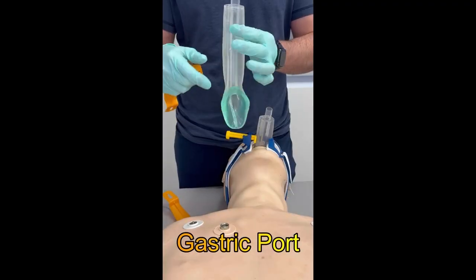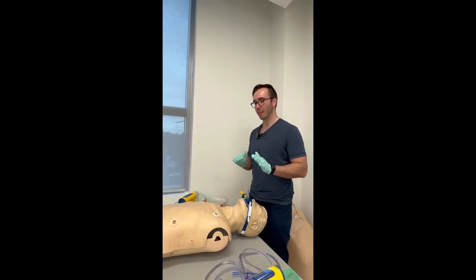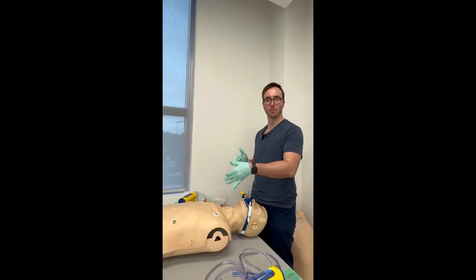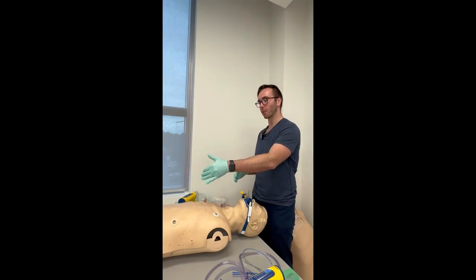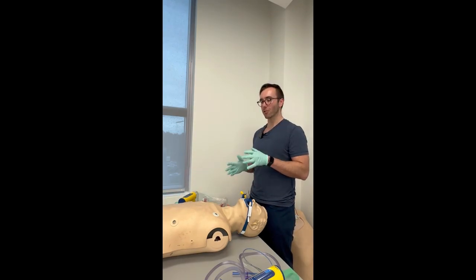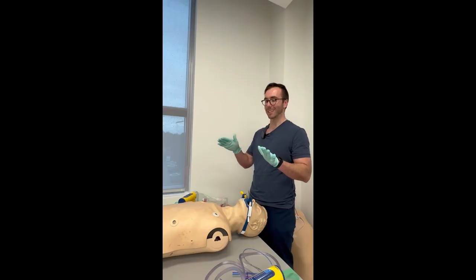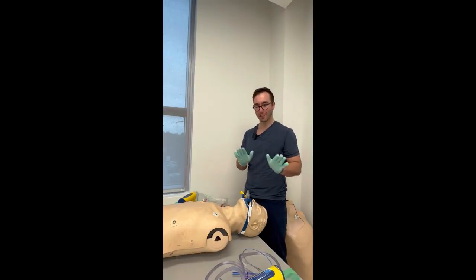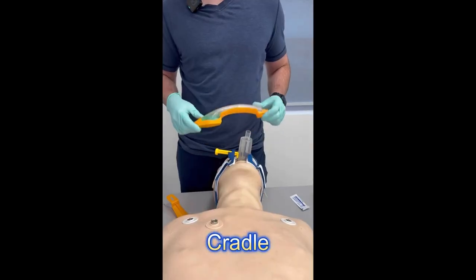There is a difference between PCPs and ACPs regarding depth of insertion. ACPs can go directly into the stomach to get rid of air and gastric secretions. The rationale is that the Schedule 3 acts only specify that ACPs and CCPs can go directly into the stomach, while PCPs can only go two to five centimeters beyond the end of the i-gel.